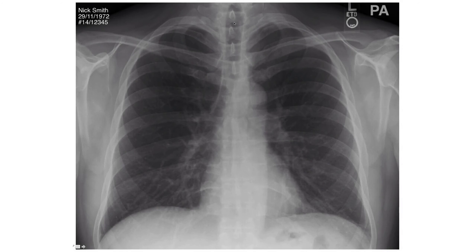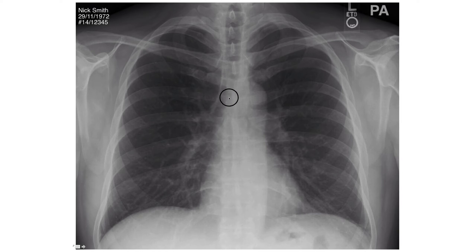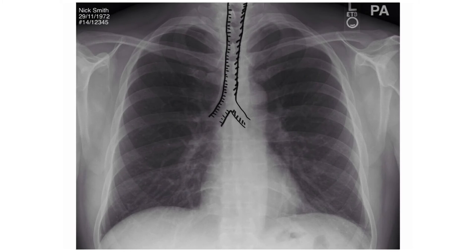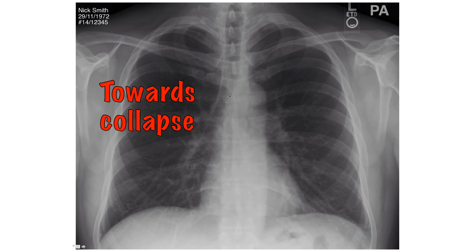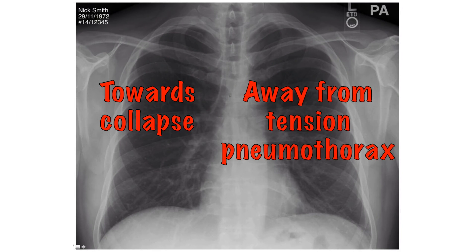Start with the trachea and work your way down. The trachea contains air so it is blacker than its surroundings. Check if it is centrally positioned or deviated to one side. The trachea can be pulled towards the side of collapse or pushed away from the side of a tension pneumothorax.